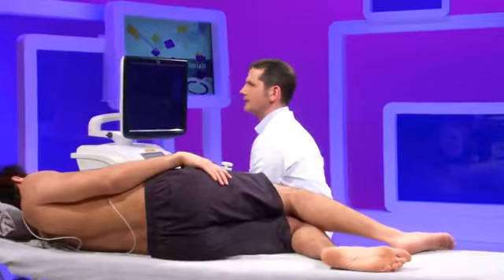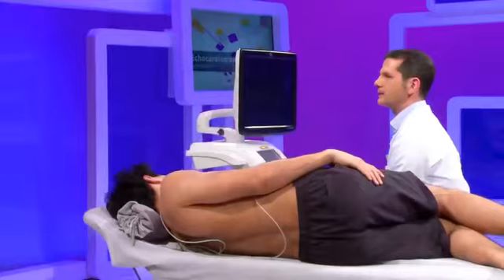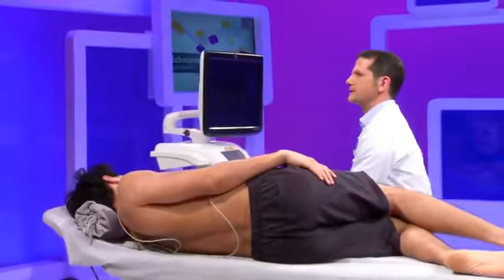In other words, if you see someone with a restrictive pattern and a short DT, in the presence of a reduced ejection fraction, one can reliably say the pressures in the ventricle are increased. However, simply looking at the mitral inflow only in a patient who has preserved ejection fraction does not allow us to reliably estimate the level of filling pressures.